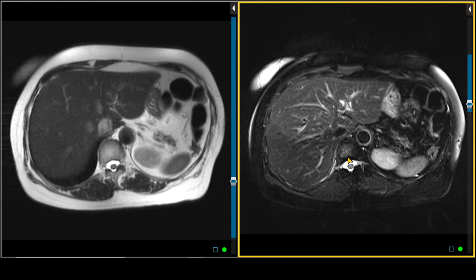As a result, you often have to do this sequence using respiratory gating, so the images are obtained at end expiration. But we like this sequence because overall soft tissue contrast resolution is much better with this sequence compared to our single shot techniques.